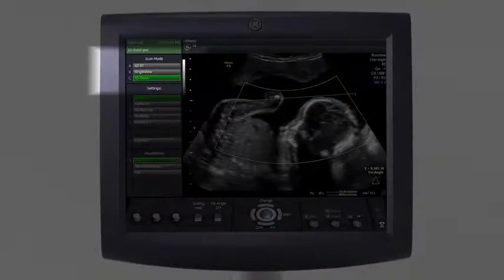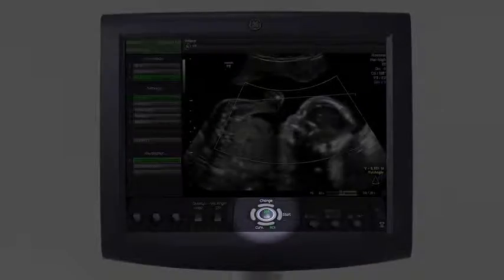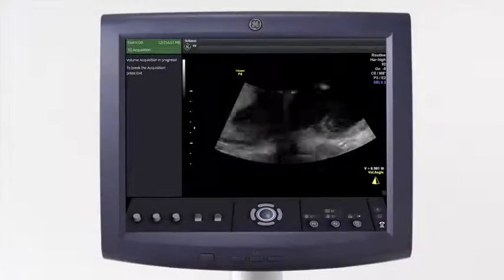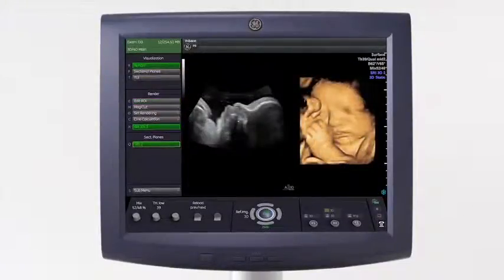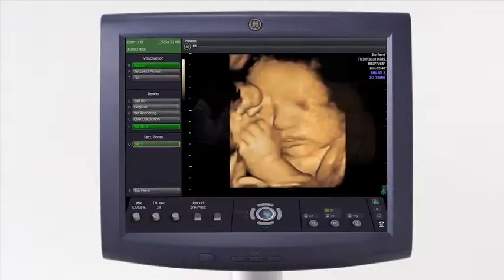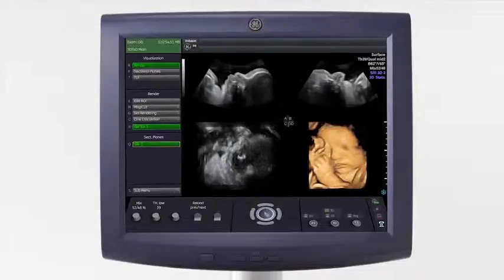Once these parameters are set, you are ready to acquire the volume, either static 3D or in a real-time 4D to help ensure clinical confidence. From the profile view, select the Start Trackball key. Once the acquisition is complete, the volume will be displayed depending on how the preset is set up. It could display in a dual display with both the rendered image and the acquisition plane, as just the rendered image, or in a quad display showing all of the orthogonal planes along with the rendered image.